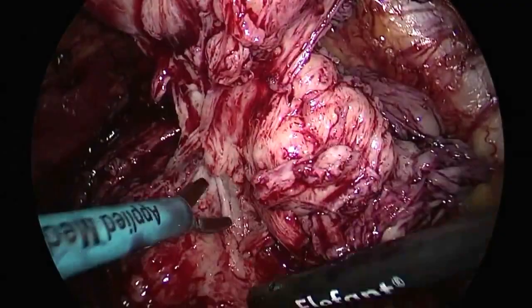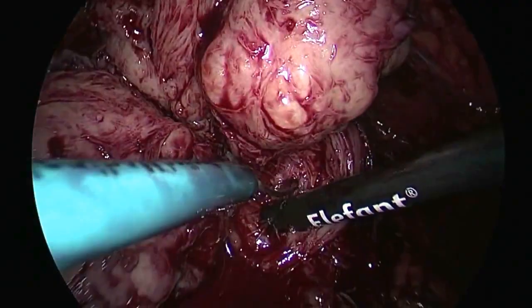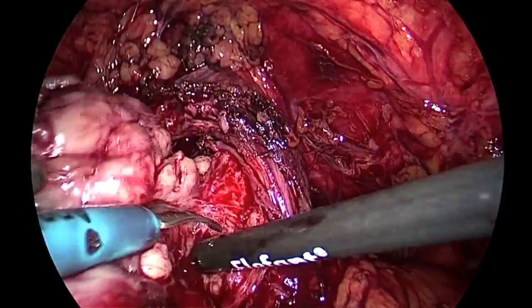Can you clean here, please? Here. This patient had 3 biopsies in the past for a PSA of more than 4 nanograms per milliliter. And so this is the reason why I have a little bit of difficulty, I think, to enucleate the adenoma here.